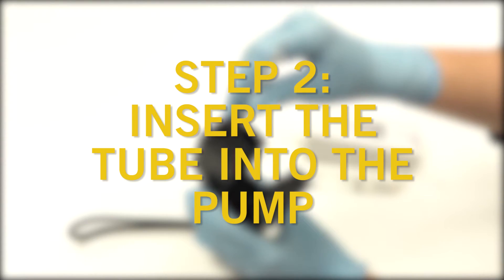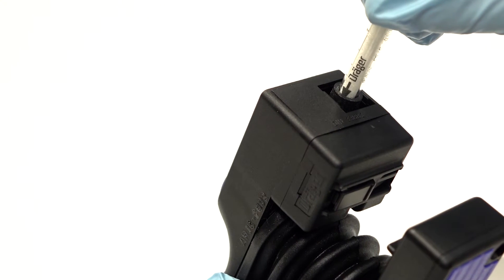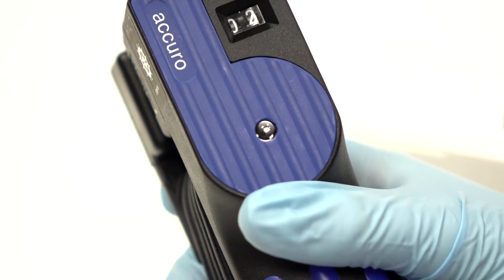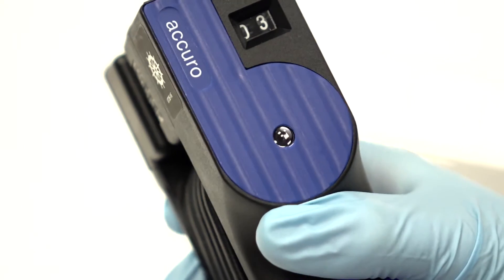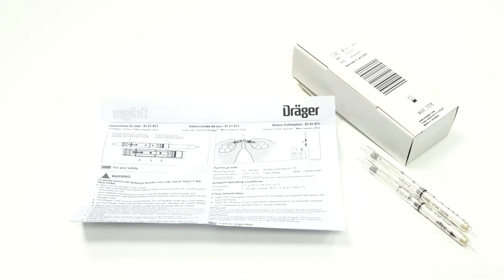Step two. Insert the tube into the Acuro pump with the black arrow facing inwards. Squeeze the pump to create one stroke. The number of strokes required will be indicated on your chosen tube pack and instructions.